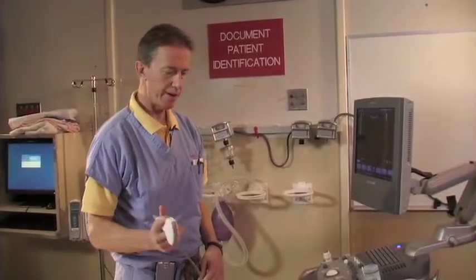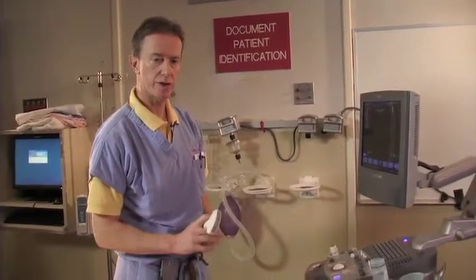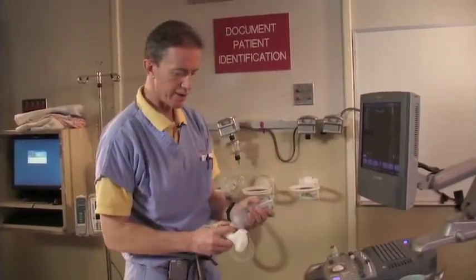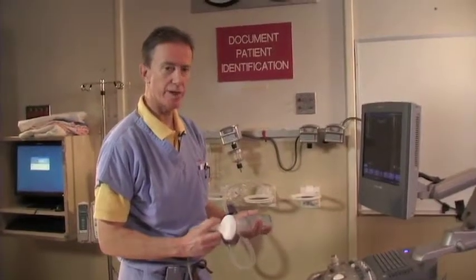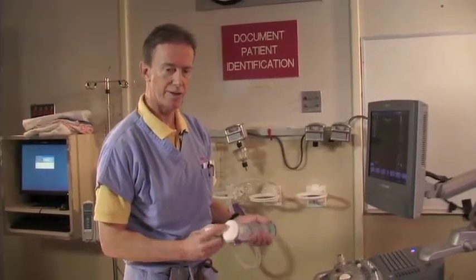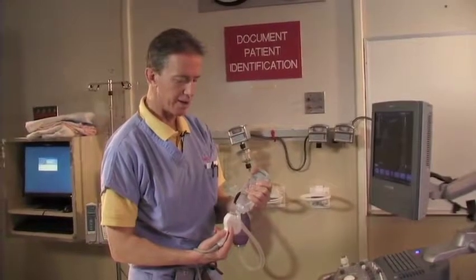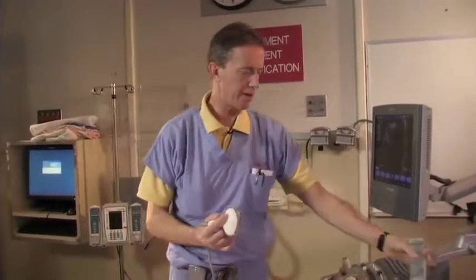We're going to start off by reviewing the anatomy of the structures of the abdomen, because once the sonologist is comfortable finding their way around the veins, arteries, and other structures, it's much easier to scan specific indications with confidence.